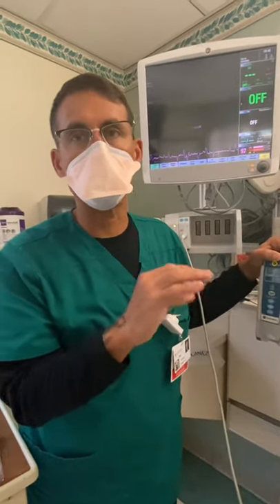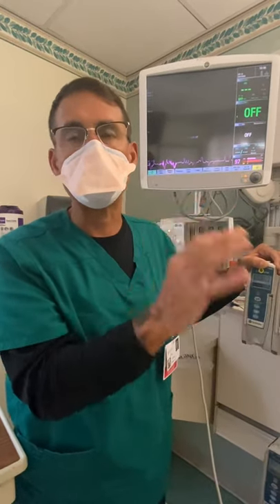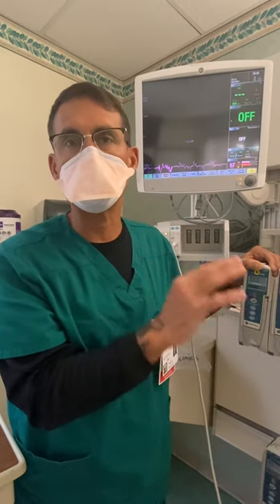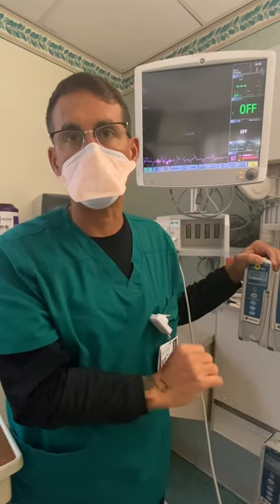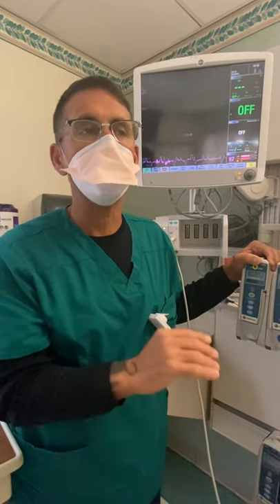The other thing that's wrong with the order is that it tells you that if you have four ticks, you have to increase your drip. That is not true. If the patient has reached vent synchrony and you have the right level of paralytics and sedation, even at a 4 of 4, you don't have to increase your paralytics. If the patient has vent synchrony, you don't touch the Nimbex. You don't touch the paralytics.